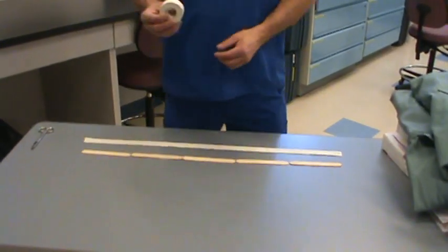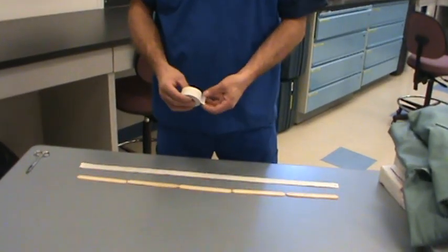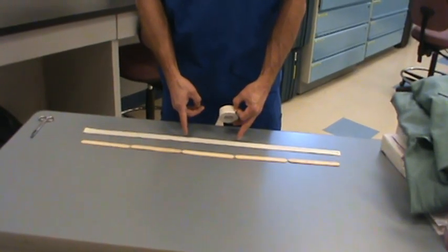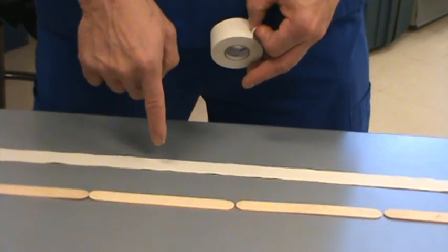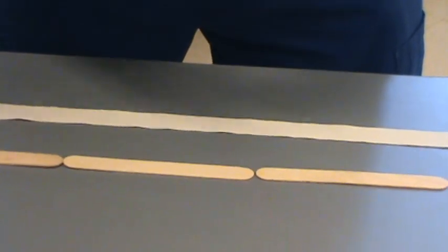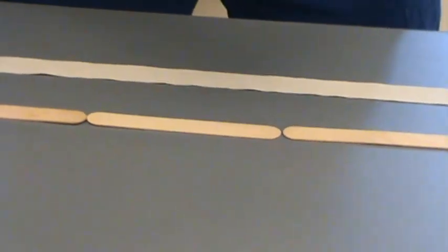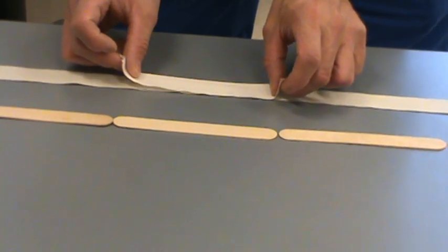The next thing I'm going to do is grab a section of tape because I need to put a part of tape down in the center of the tape that I cut so that the sticky part of the tape does not touch the patient's hair or the back of their neck, because that'd be kind of painful for the patient. So tear off a little bit of tape like so, roughly the length of a tongue depressor. Cut it or tear it in that fashion, and place it right in the center of your tapes, right about here.